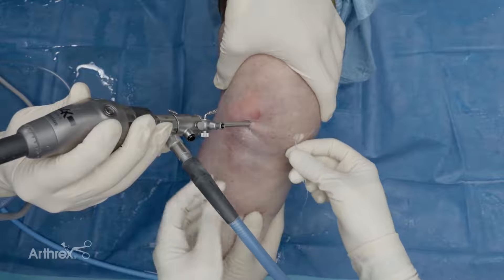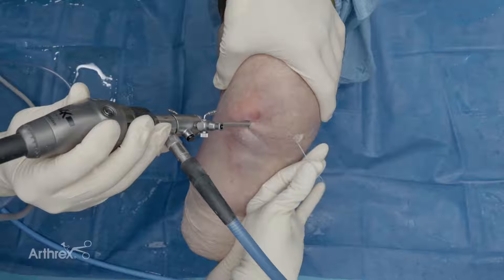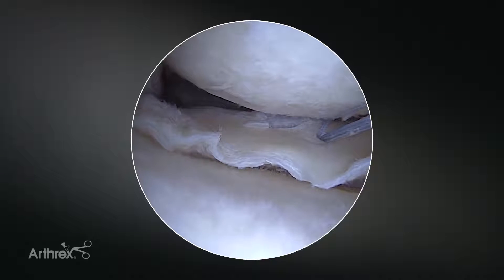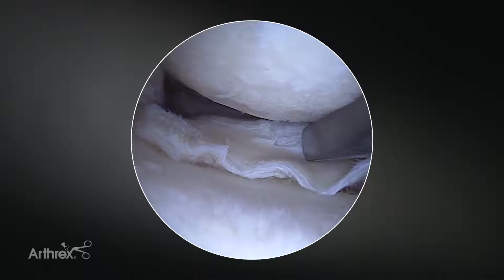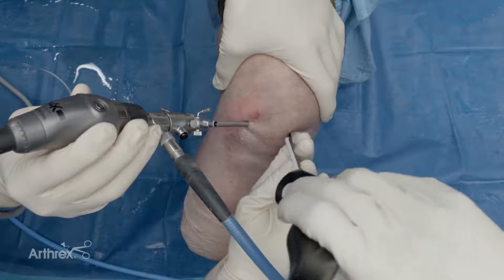I'm going to grab all of them together and just gently pull to set the anchor initially. Then I'm going to take a clamp and clamp them all together and leave it. So when I come in with my sled for the subsequent stitch, you can see the benefit of starting peripherally and working more centrally, because that stitch is now out of my way. I'll come in with the second implant.